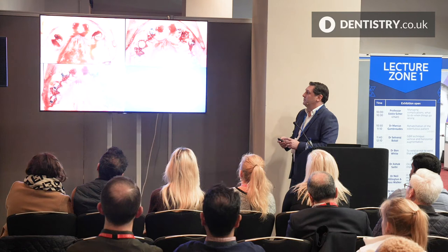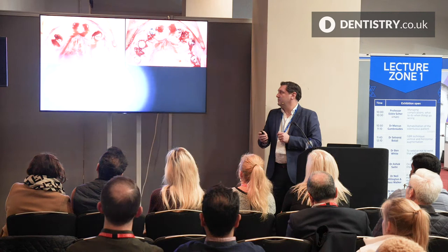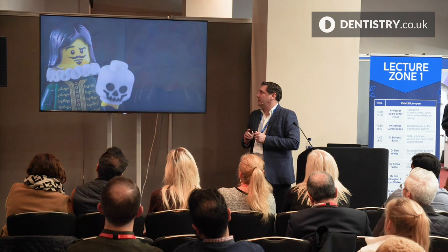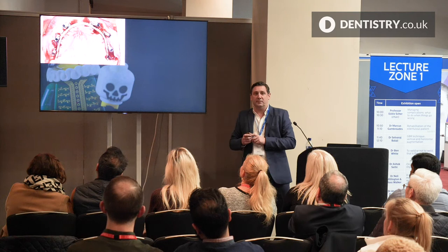We then put our temporary cylinders onto those implants. Now these come in different angulations, 0, 10, 15, and 25. We put them into place. We then take our 2 millimeter titanium wire and we bend that into shape. Usually the technician will bend that into shape for me, and then we spot weld that to each of the cylinders. And that provides a very solid connection. So it provides a framework for our temporary bridge.